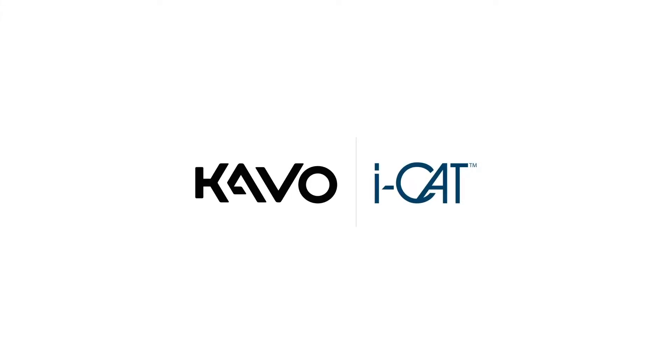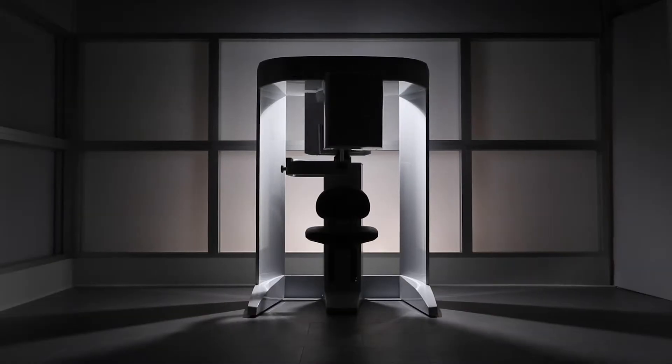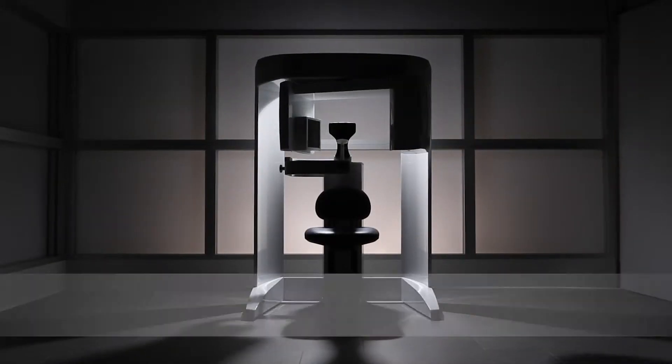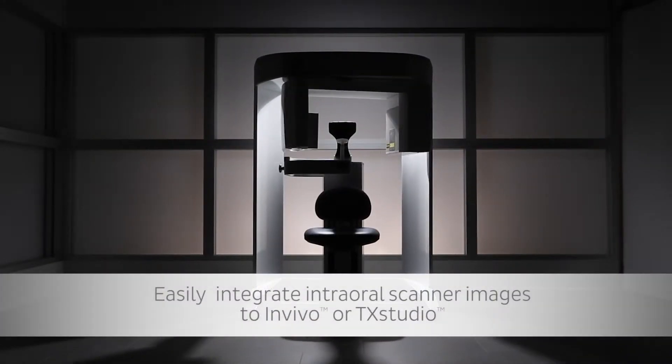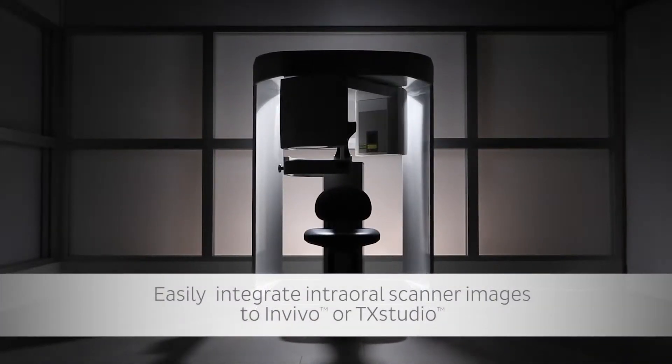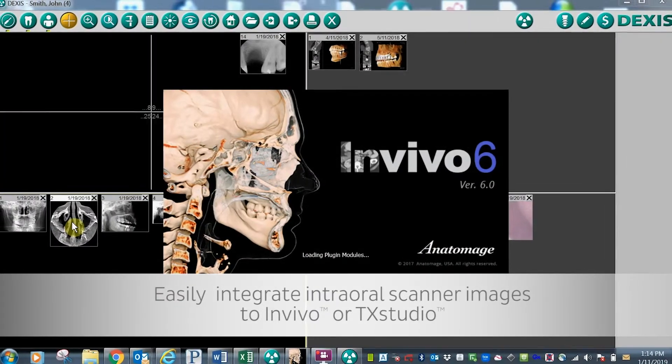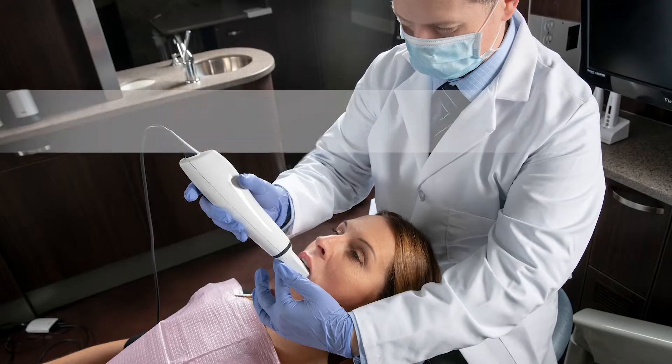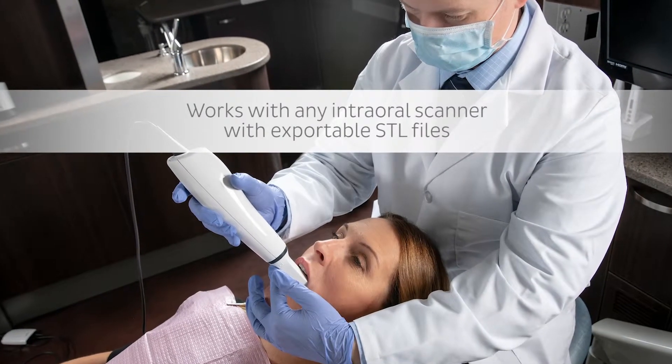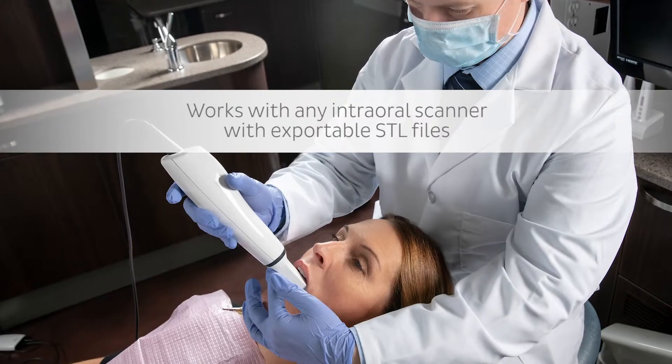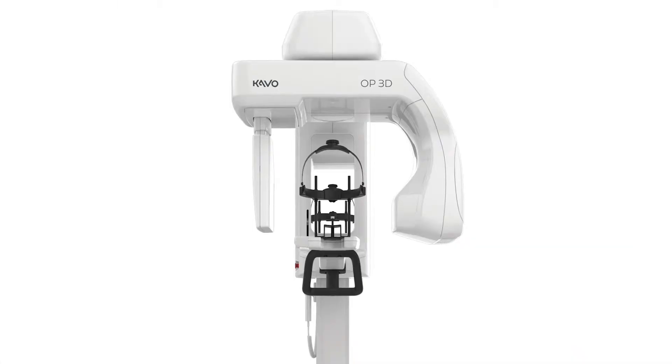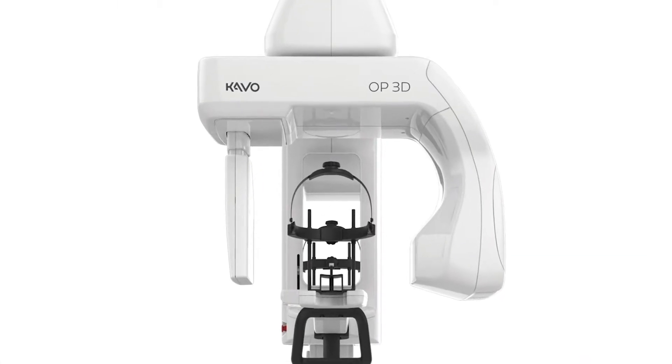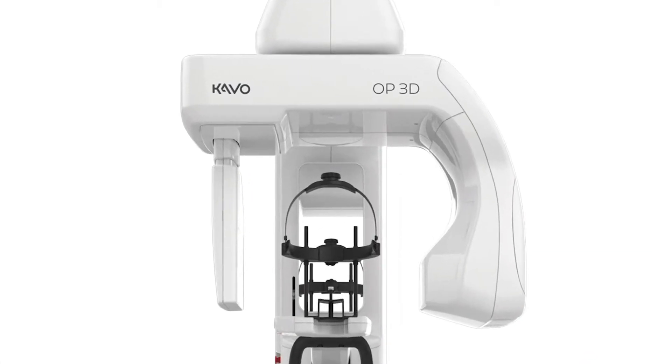If you have an intraoral scanner or are looking to purchase an intraoral scanner with CBCT, look no further. 3D imaging from KAVO and iCAT can seamlessly integrate into InVivo. Any intraoral scanner with exportable STL capabilities can be easily integrated with the KAVO and iCAT systems.